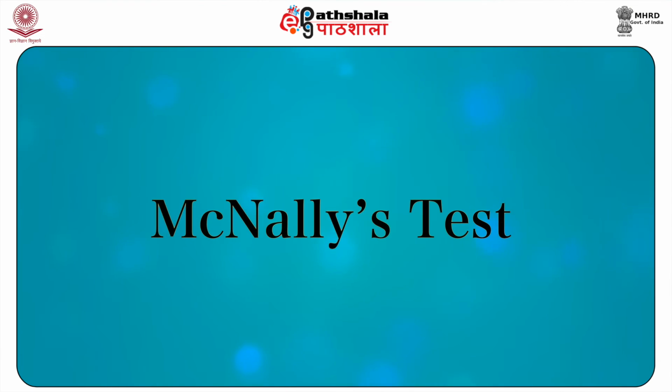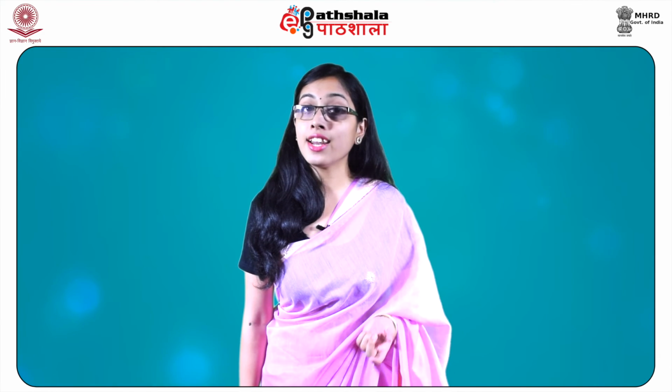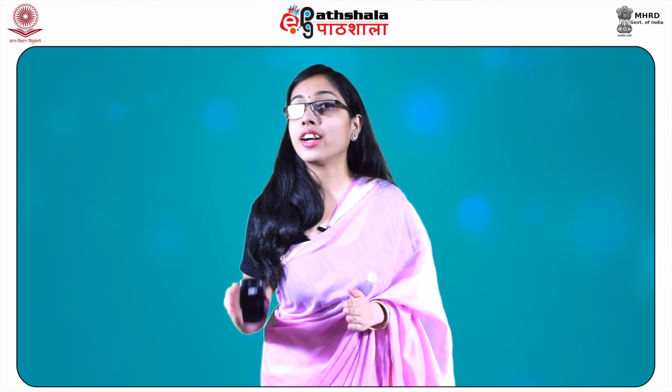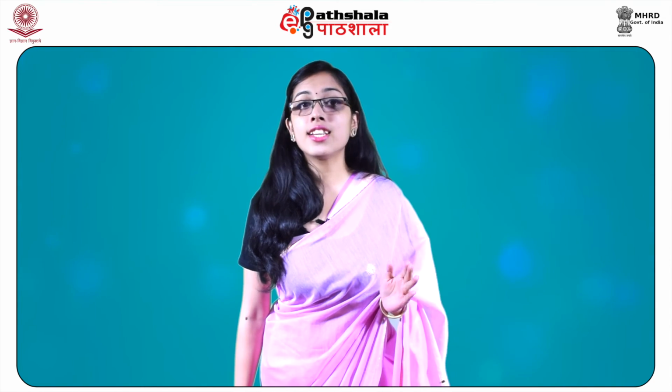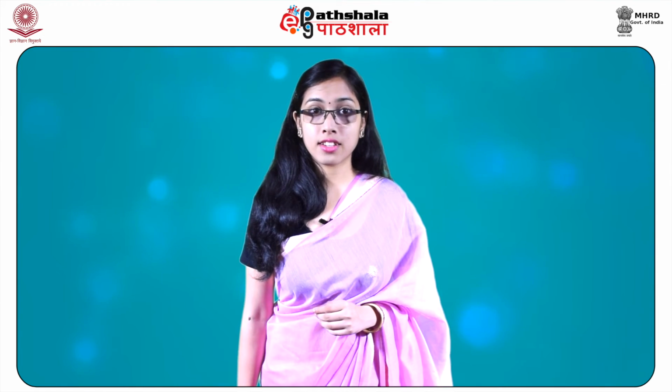Next is McNally's test. To the residue of the extract of biological materials, a few drops of acetone and 1 to 2 ml of water are added. 2 drops of 0.5% copper sulphate solution and 10% acetic acid are added, followed by a pinch of solid sodium nitrite. It is then shaken and heated gradually to boiling and maintained in the boiling condition for a few minutes. A red color is formed if salicylates and salicylic acid are present.